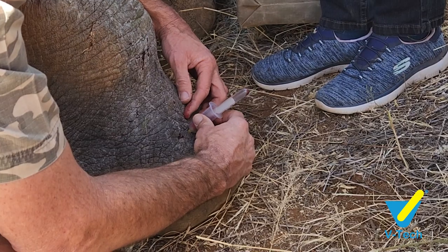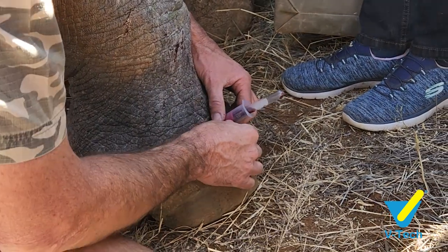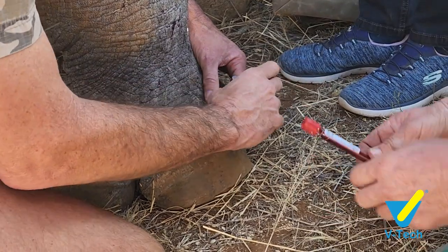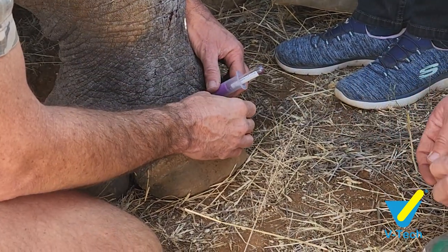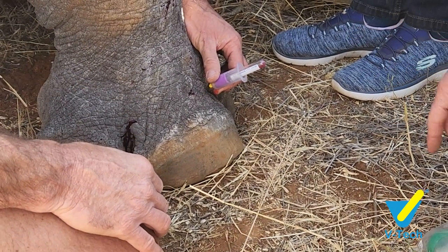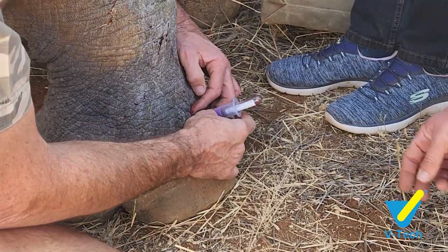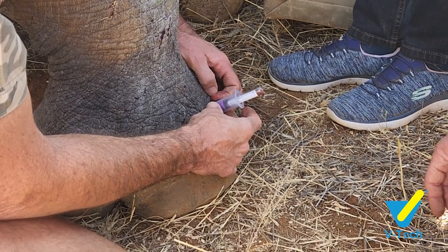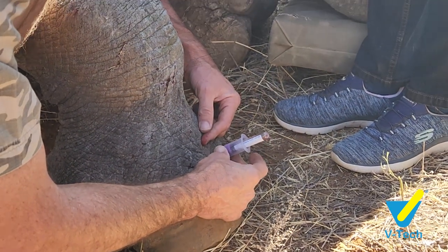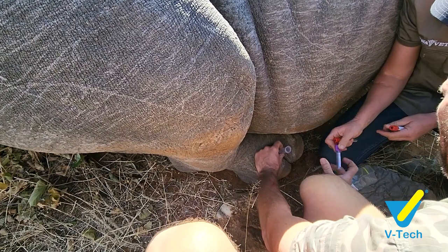You can get quite a few test tubes from that site, and the vein doesn't collapse as easily as the ear vein when you need multiple tubes. To recap: it's between the two toes, just where the toe starts to come out of the foot — not at the bottom where the nail is, but a little higher up. Go in at about a 90-degree angle, all the way in, then pull back slowly, and once you hit that big vein, the blood will come pouring into the test tube.